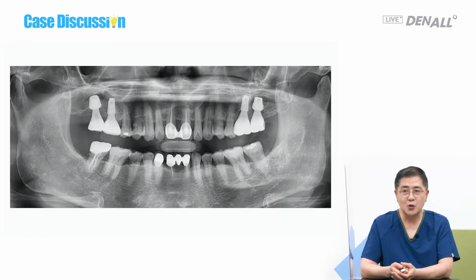At number 17 and 27, 7 millimeter implants are placed. It was not intentional. Due to lack of initial stability, the size got bigger and eventually achieved the initial stability. In this case, this is not a routine technique, but you can do it this way.